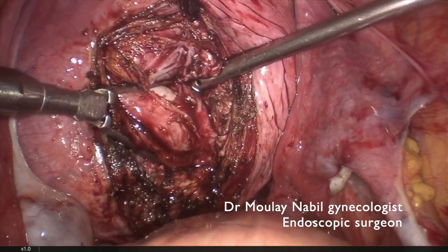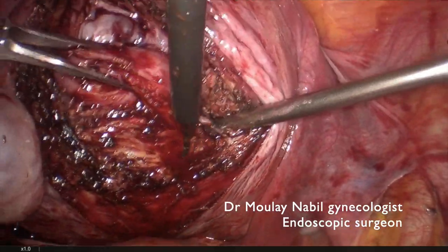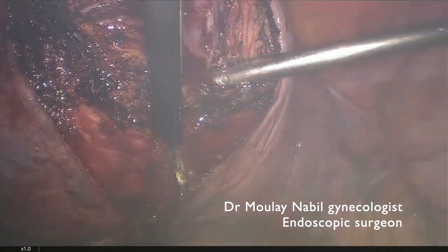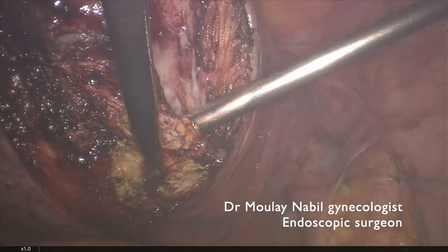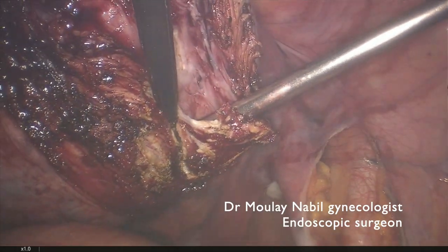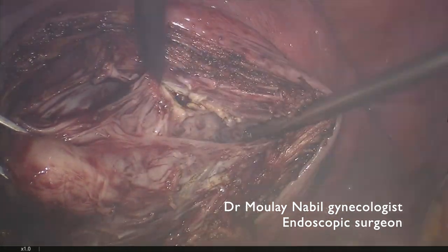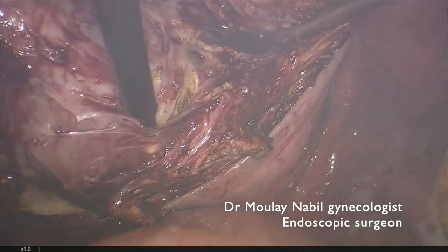We grasp the myoma with the 10 mm forceps and by traction and countertraction, we use the aspirator to clean our operative field and continue to open the pseudocapsule with the monopolar loop. When we find the plane between the healthy myometrium and the myoma, we begin to remove the myoma progressively from its bed. As stated before, this is a huge 10 cm cervico-isthmic myoma.